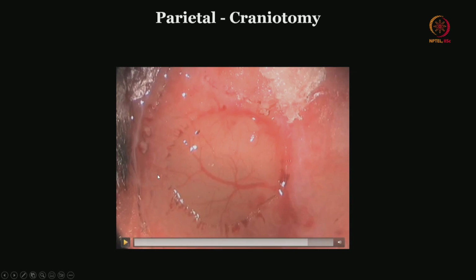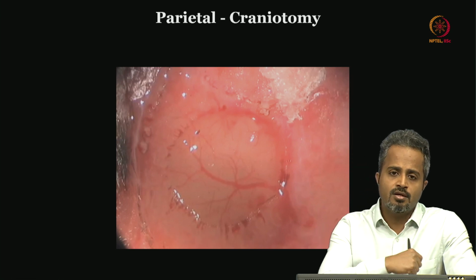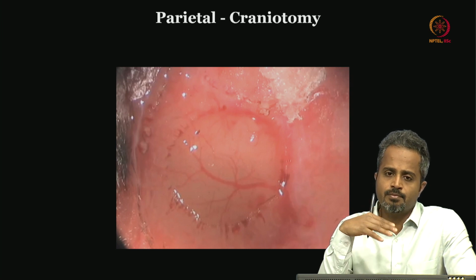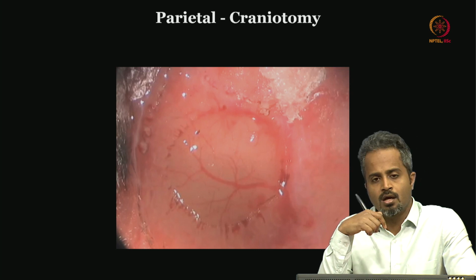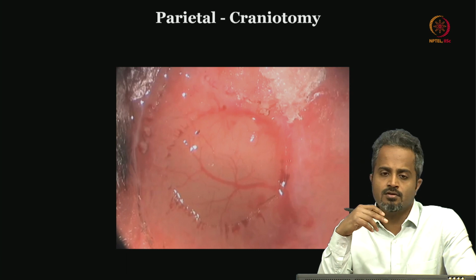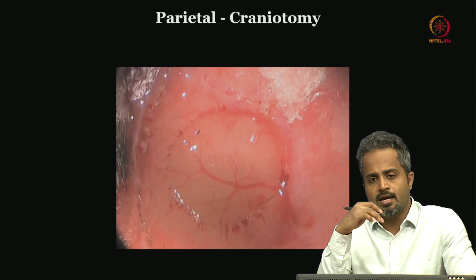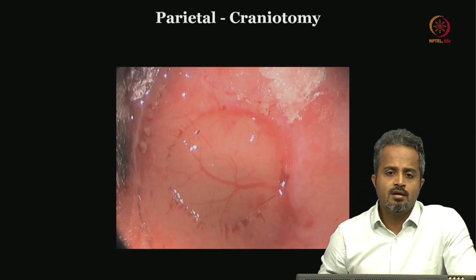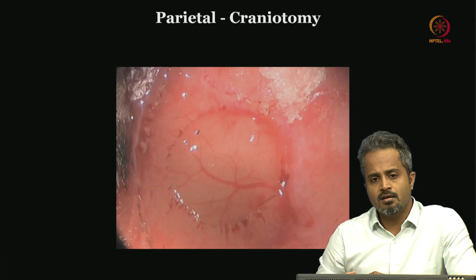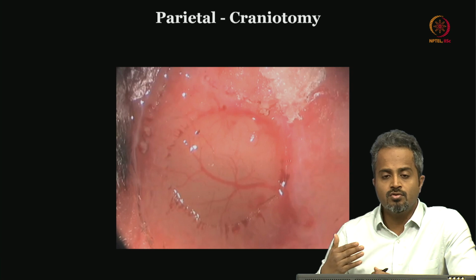But it may not be that thin in the case of the Wistar rat or older rats, wherein you need to sort of deepen this groove and make sure that it is completely separate from the edge of the bone. And that is made sure by giving a firm pressure on the center of the craniotomy bone, and see if it is separate from the remaining part of the skull. Once it is confirmed, then only you are going to lift it up. And it is very important in that process where you elevate the bone table not to injure the dura.